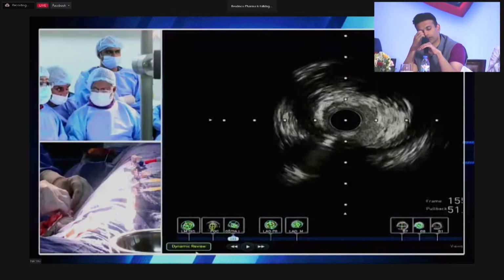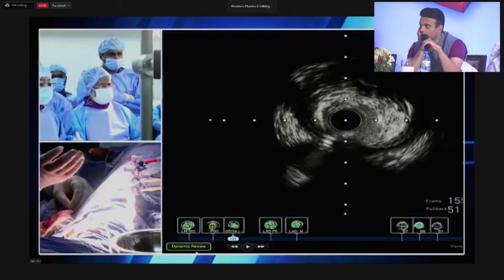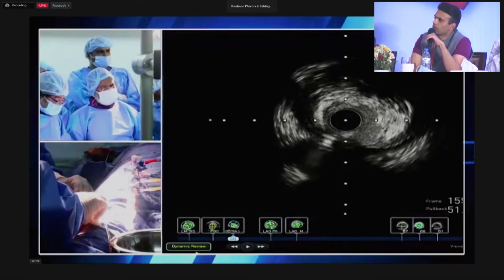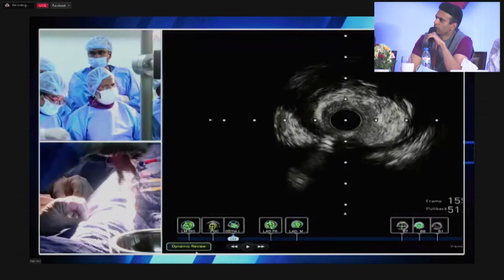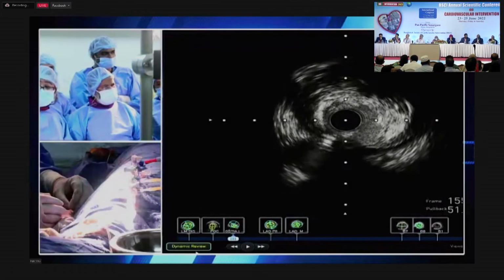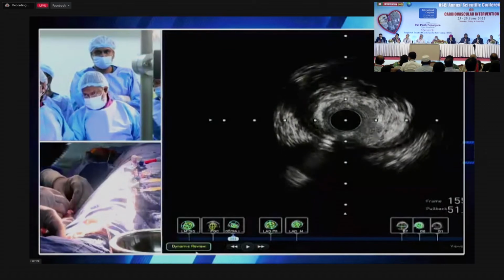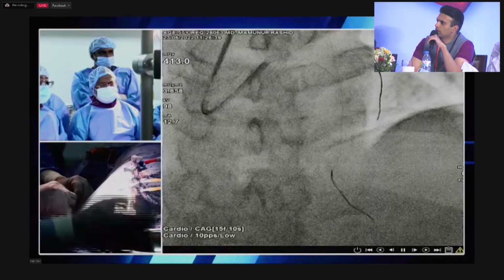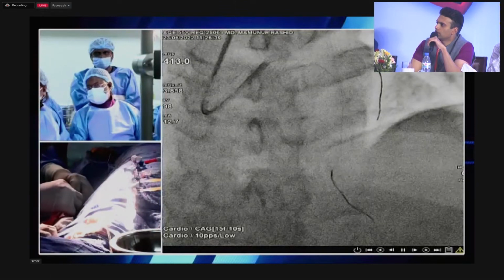Dr. Mir Jamal, with Dr. Gambhir's comments, I think we both settled on a provisional approach. For what it's worth, when you go back to the left main, if you want to go to the distal left main on the IVUS, can you come to the distal left main on the IVUS, please? Yes, yes. Distal left main, show them.